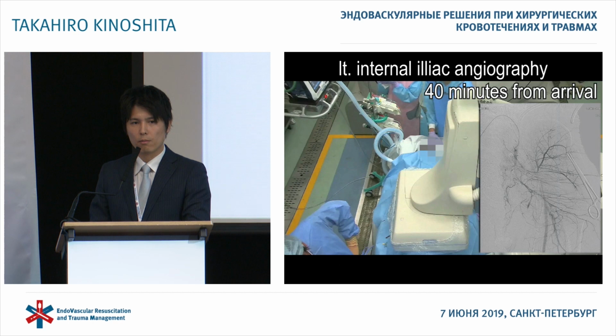In this case, we performed internal iliac artery embolization and saved the patient.